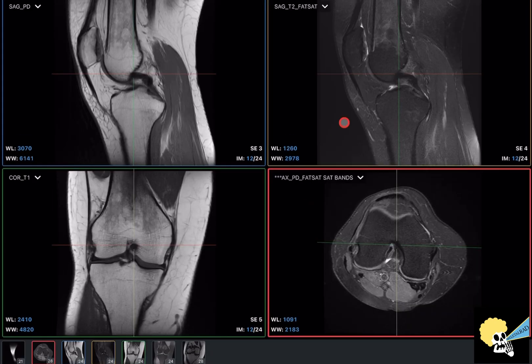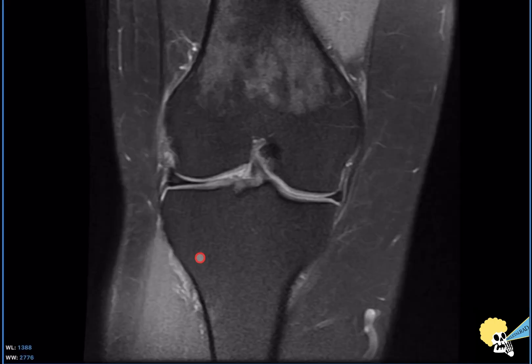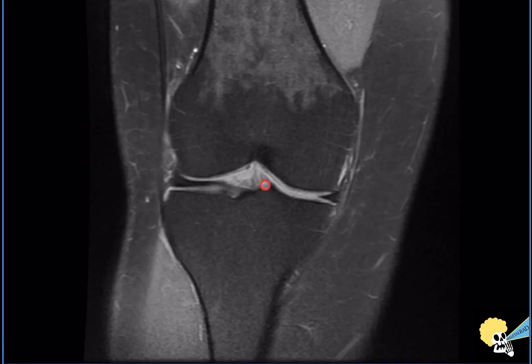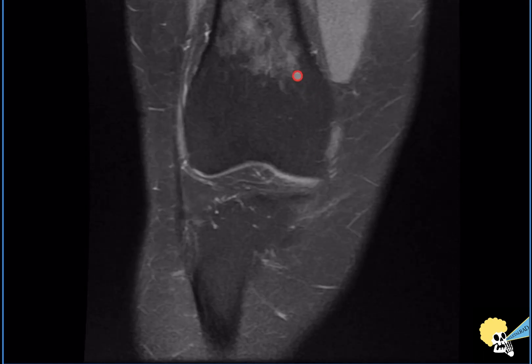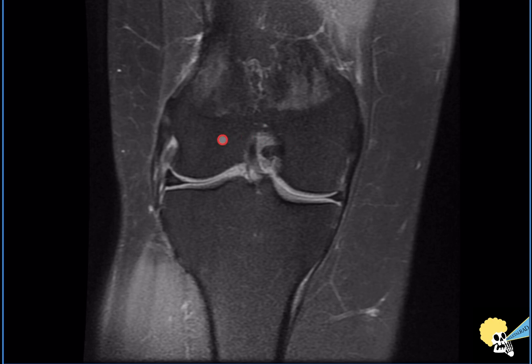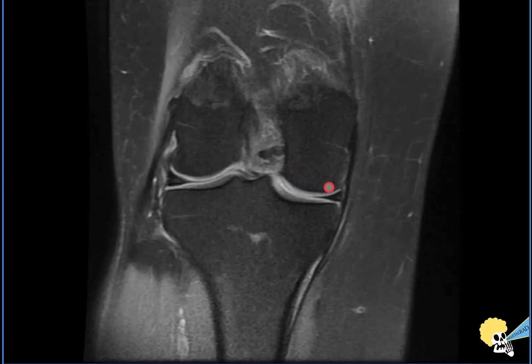After this, I jump to the coronal images in proton density or T2 with fat suppression. Here I'm looking at the cartilage — the weight-bearing femoral condyle cartilage and the tibial cartilage. I'm also looking at the bone marrow, and here I do look at the subchondral bone, making sure there are no subchondral cysts that may suggest some kind of chondromalacia not clearly seen as a cartilage defect.